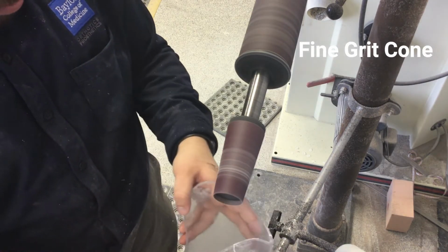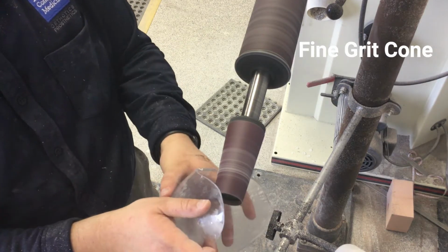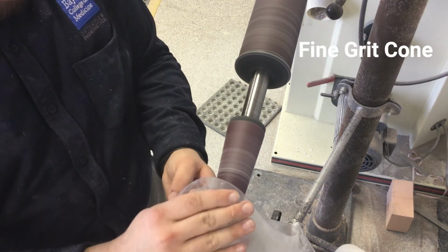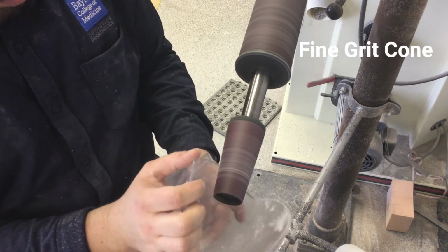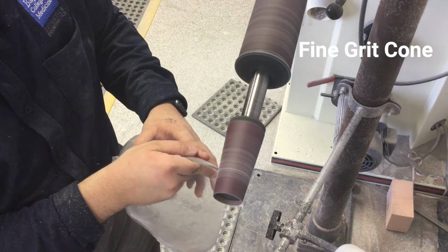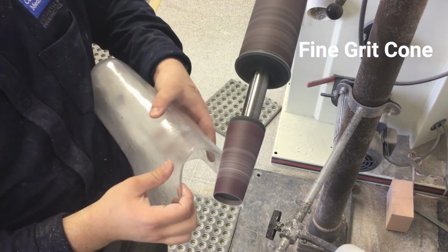We will start by tilting the socket to be at a 45-degree angle to the cone. We are going to pull along this edge with slight to moderate pressure using long motions pulling towards yourself. This will be done along the whole inner edge of the socket.